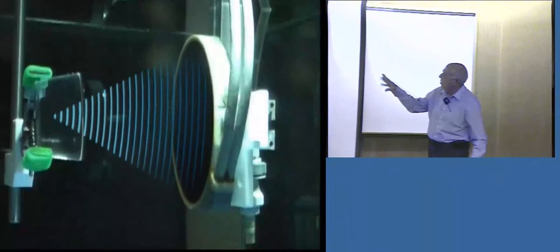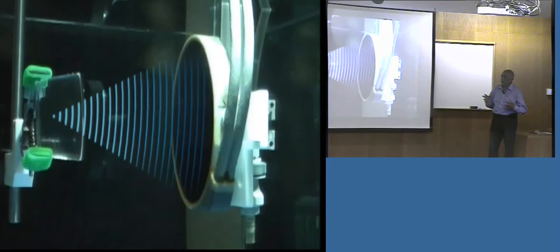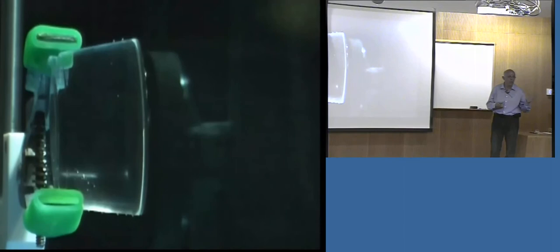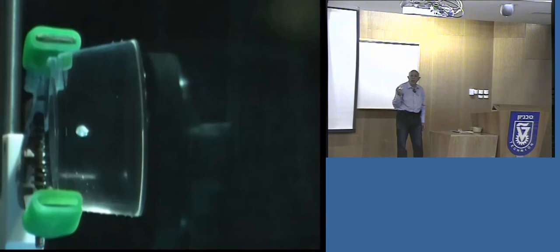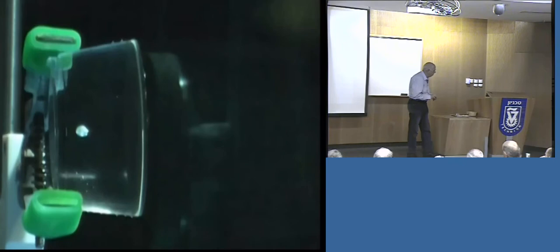On the left-hand side, you see a phantom, a tissue-mimicking phantom which is fully transparent to ultrasound. It mimics the acoustic characteristics of human tissue. What I'm going to do is operate the transducer, focus it in the middle of this target, and you'll see the effect. You'll see where the focus will be. We'll hear the power supply working, there will be a click which is the power on. You see now the bubble formed, a boiling bubble inside. This is the result. There's no damage except in the focal point. Think about this in your brain, targeting a lesion without cutting.